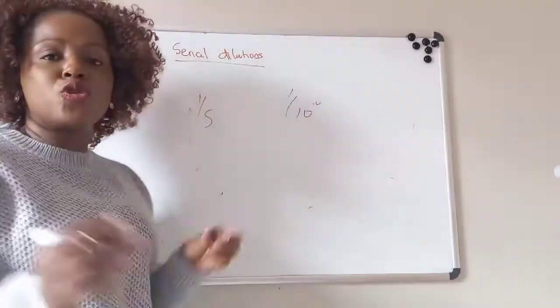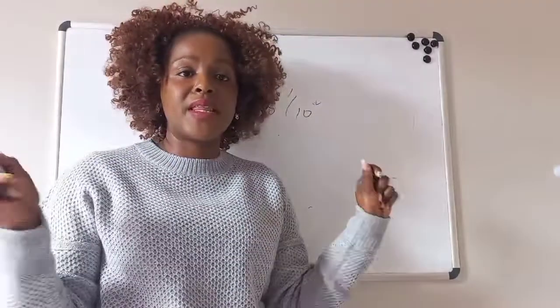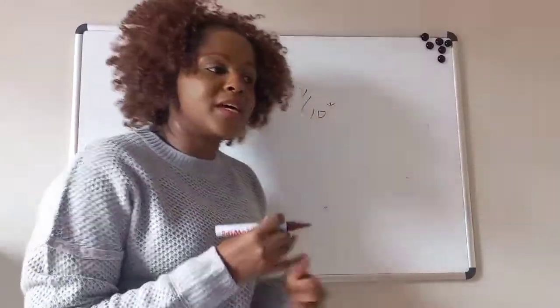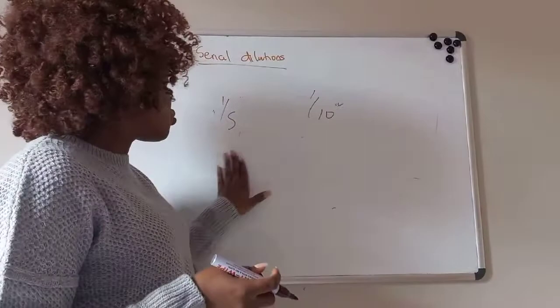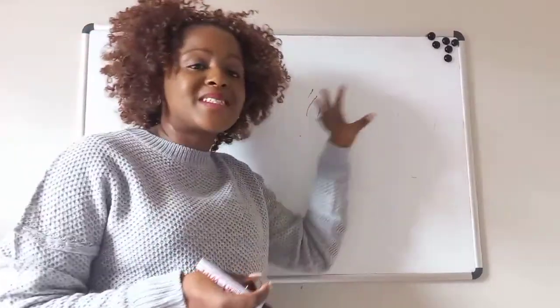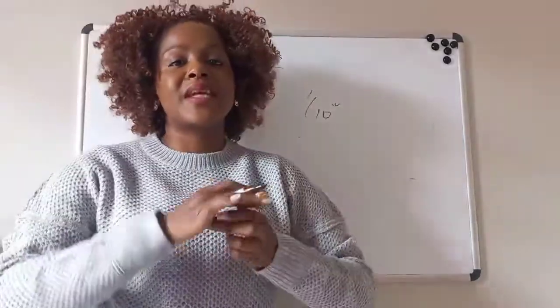So this is what your SOP is saying. Amikacin, when it's greater than, you have to do a 1 in 5 and a 1 in 10. So now what happens is that you have run these two solutions. You've done them already, but still the result comes out as greater than.